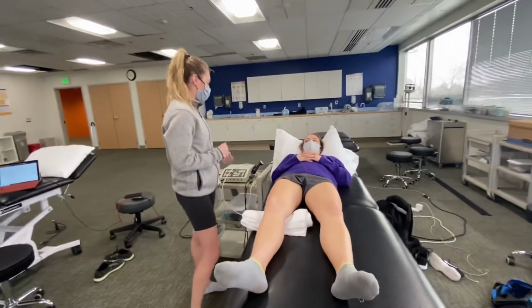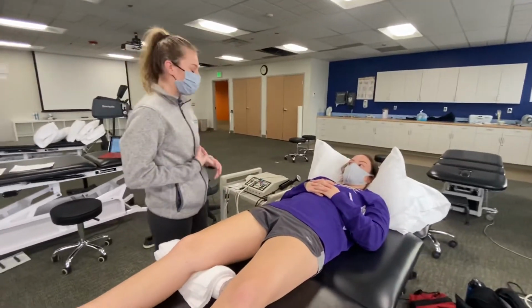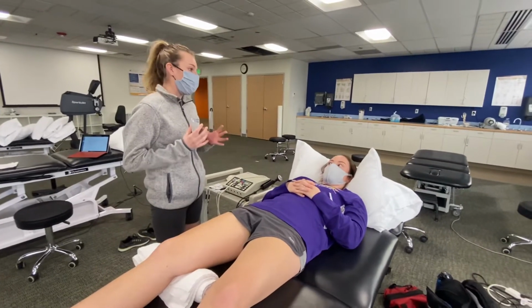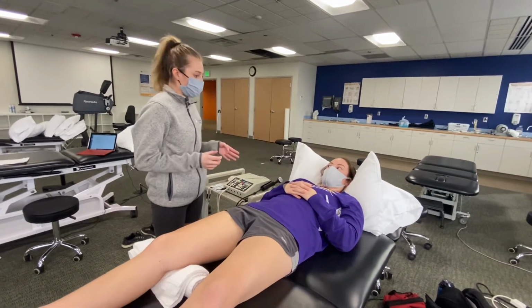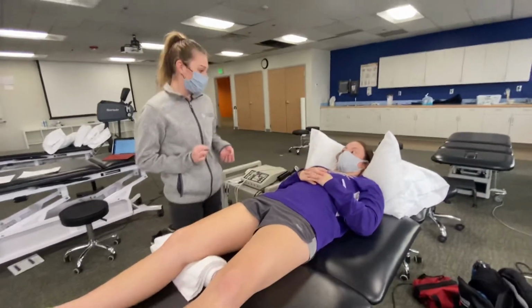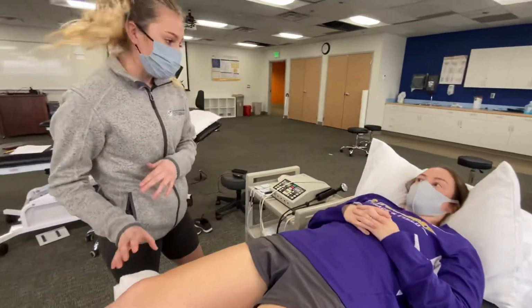So what we're going to do today is place these pads on your knee, and it's a really comfortable tingle, and it's just going to lower your pain by blocking the pain signal to your brain. It should make it feel very good. Does that sound like something you want to do today? Yeah. Okay, sweet. Is it all right if I touch your knee? Mm-hmm. Okay.